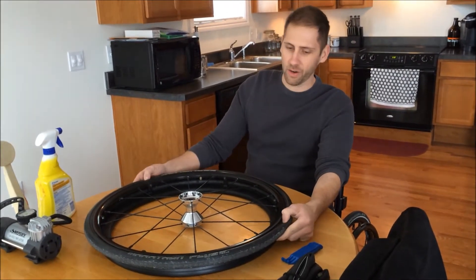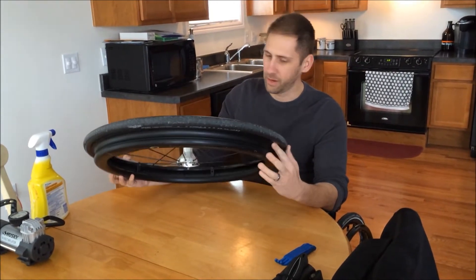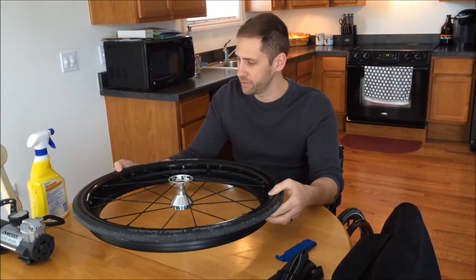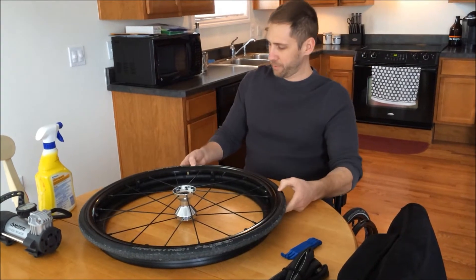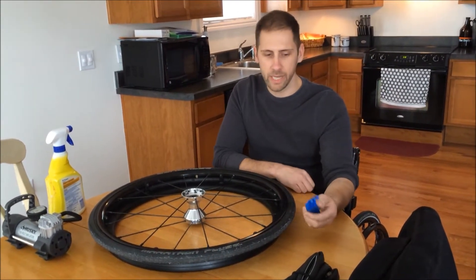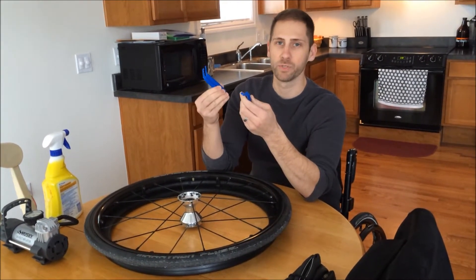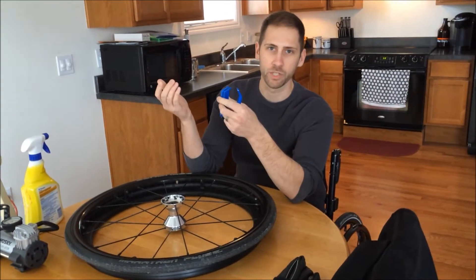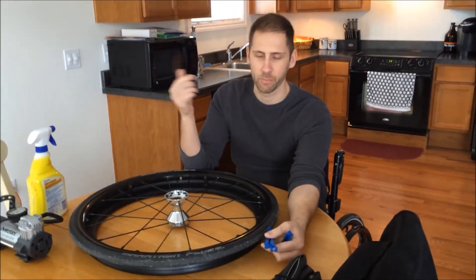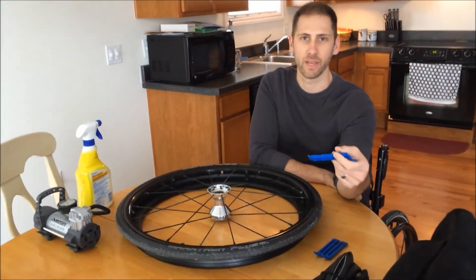This is a tire that I've already deflated. I'm actually taking off the push rim and this push rim guard, but I figured I'd do a video on pretty much the same process if you have to replace a flat. So what you're going to need are these tire levers. You can get these at any bicycle store because essentially a wheelchair tire is just a bicycle tire with a push rim. These are very, very cheap — I think you can get these for less than $5.